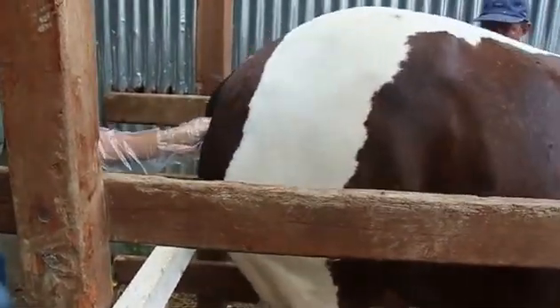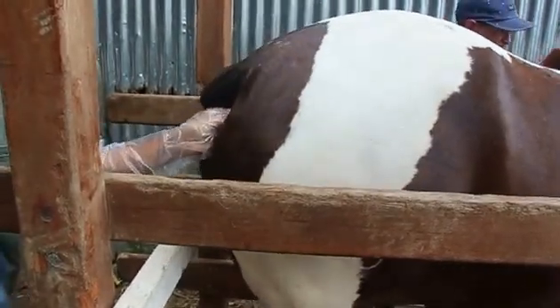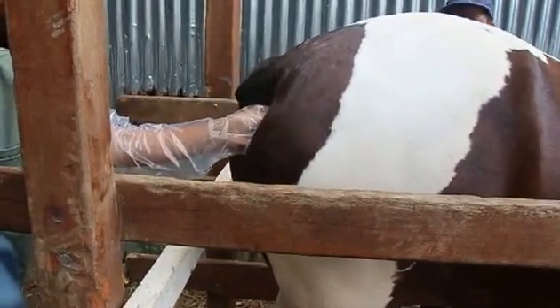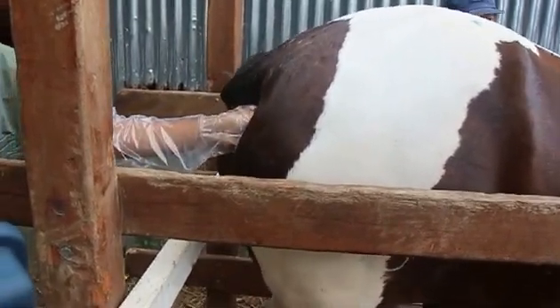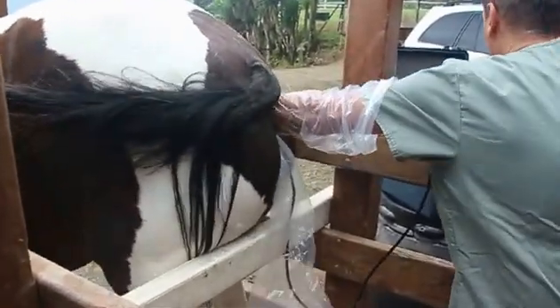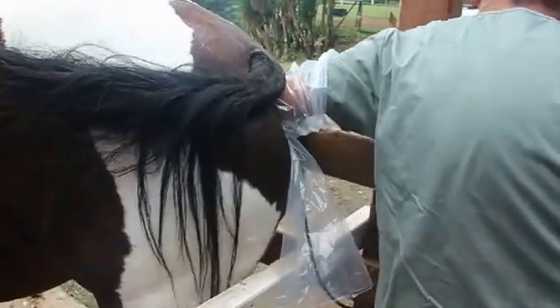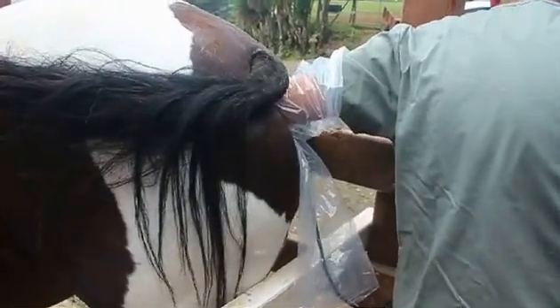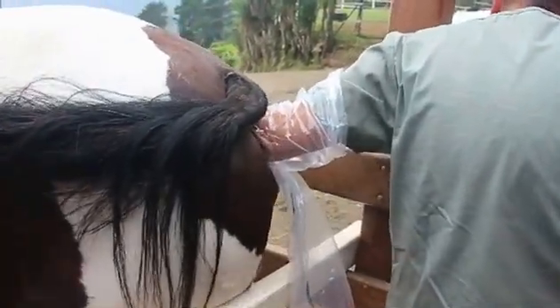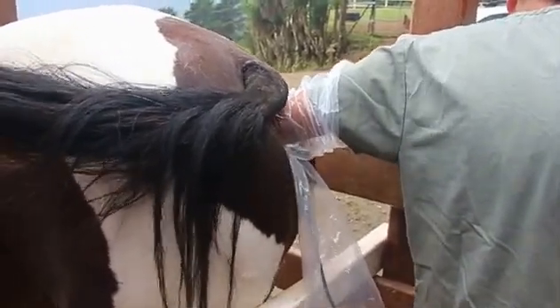He probably didn't think about that when he signed up to become a veterinarian. Of course she doesn't like it — we're talking to her, trying to keep her calm. We normally do these ultrasounds on all the mares once at the beginning to see if they are indeed pregnant, then at about the two-month point to make sure they don't have twins. Horses should not be allowed to give birth to twins. Then we typically do it one more time towards the end to make sure everything is okay and we have a good date marked for the birth.